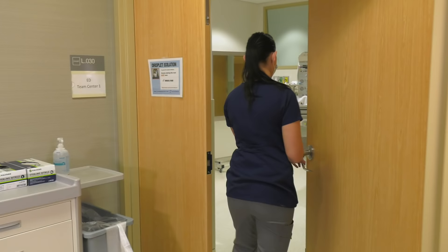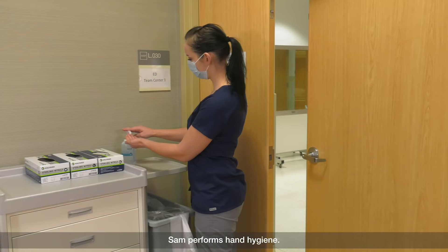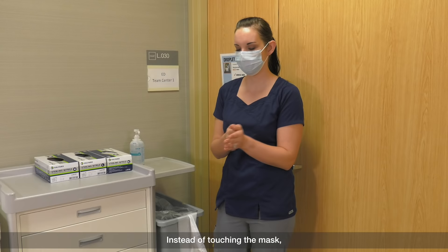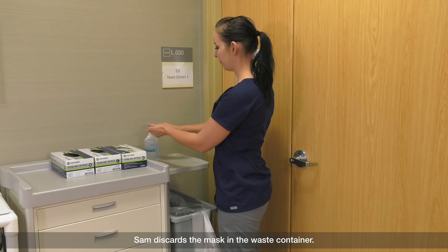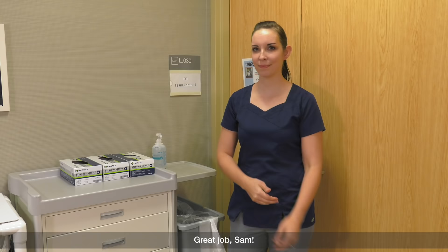Sam knows the front of her mask is contaminated. Sam performs hand hygiene. Instead of touching the mask, she grasps the ties or elastics of the mask, carefully removing the mask without touching the front. Sam discards the mask in the waste container. Sam performs hand hygiene. Great job, Sam!